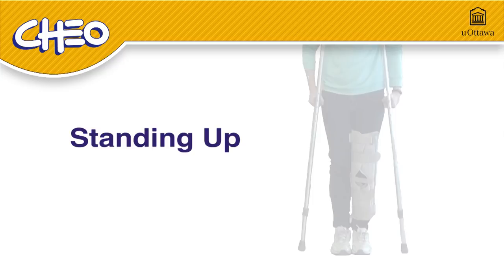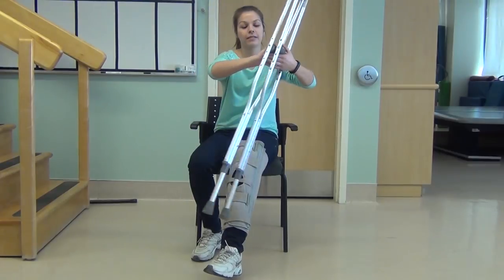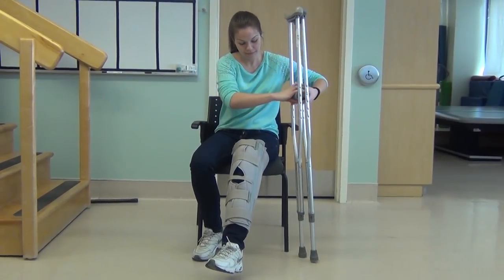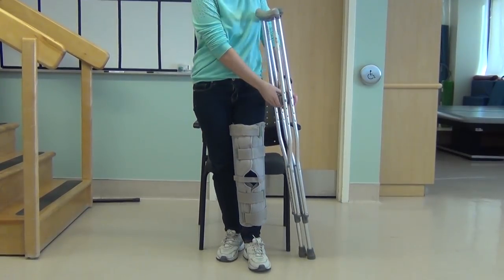Standing Up. Slide to the edge of the chair. Place both crutches in one hand and hold them by the handles. Stand up by using your good leg and pushing off the armrest at the same time.